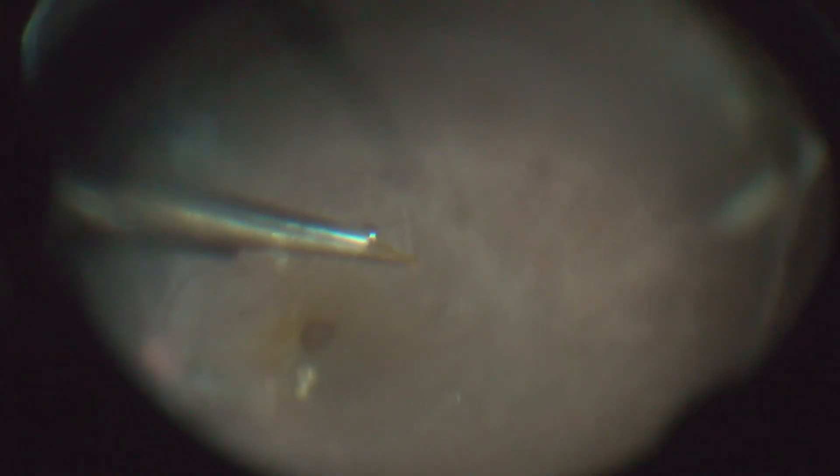We notice here that there are two small air bubbles just inferior to the fovea, and they are opposite in location to the PFCL bubble. They move according to how I tilt the eye.